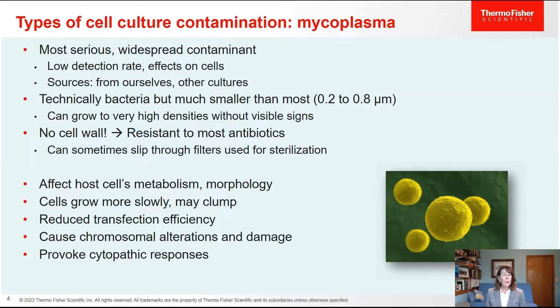Mycoplasmas have very negative effects on your cells — they can affect host cell metabolism and morphology. The first clue might be that your cells are growing more slowly, with more dead cells or clumps. If you used to split cells two to three times a week and now only split them once a week, that might indicate a mycoplasma contamination. The biggest tell for me is dramatically reduced transfection efficiency. Mycoplasmas can damage the cell's DNA, cause chromosomal aberrations, provoke innate immune responses, cytopathic responses, and stress responses.